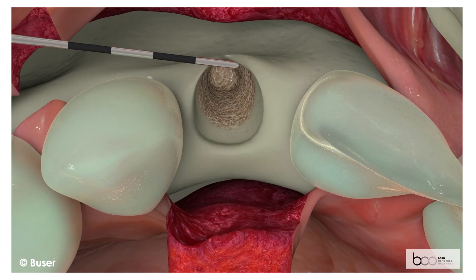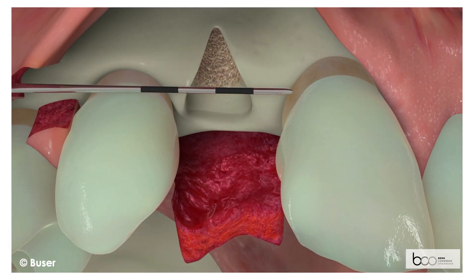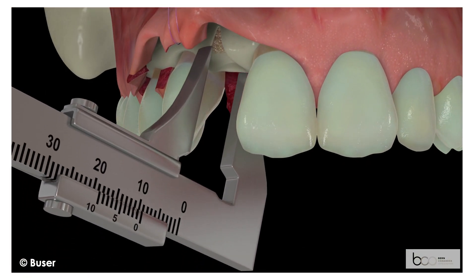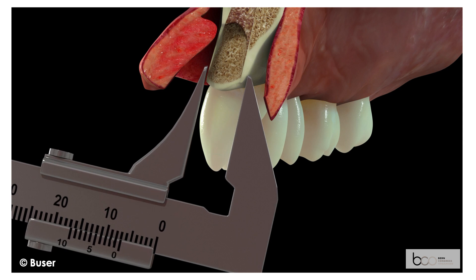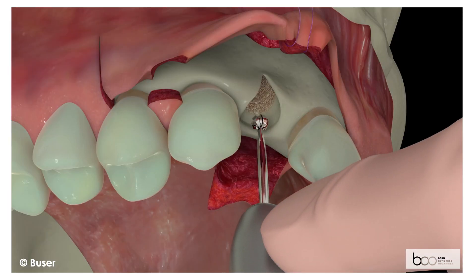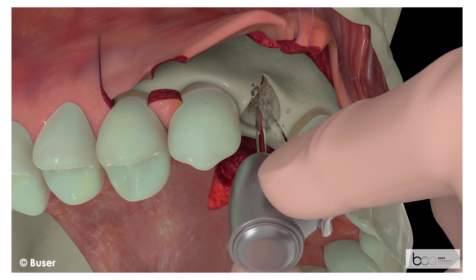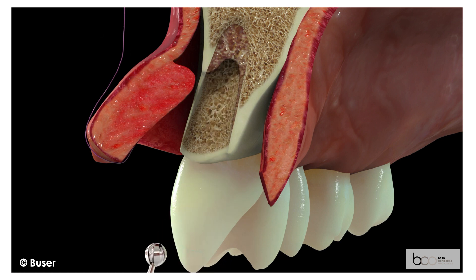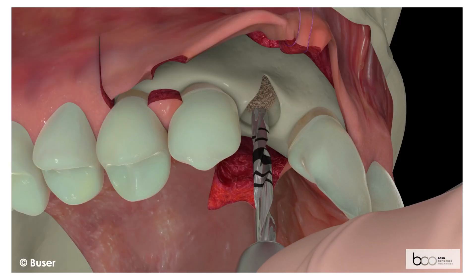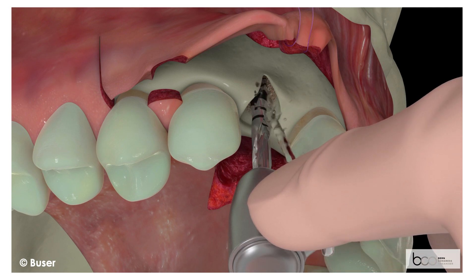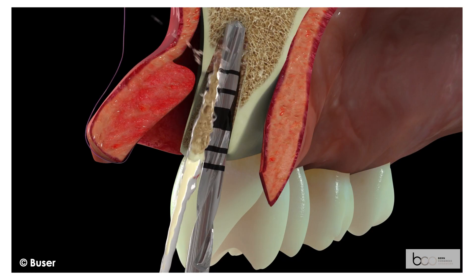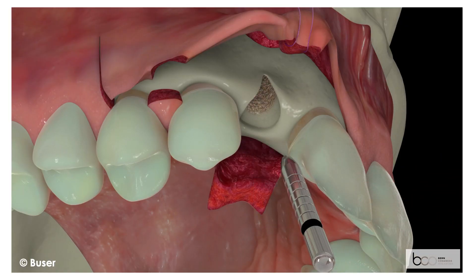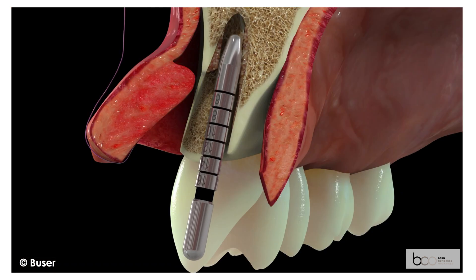The surgery continues with examination of the local anatomy using a periodontal probe. The crest width is analysed with a caliper, which should measure at least 6 mm oro-facially. Implant bed preparation is initiated with a number 2 round burr preparing into the apical bone structure, followed by the first spiral drill of 2.2 mm diameter at a drill speed of 800 rpm. Bone preparation is done with copious cooling using chilled sterile saline. The depth gauge is inserted to check the sink depth and the implant axis.